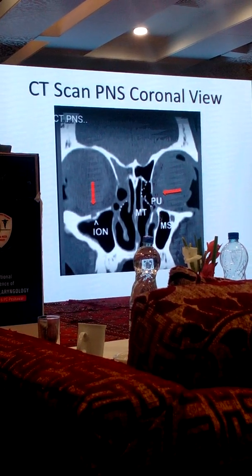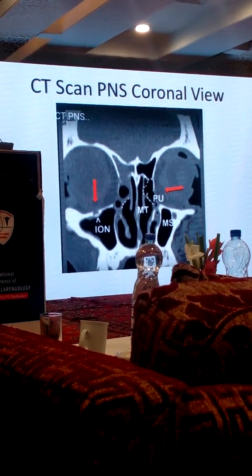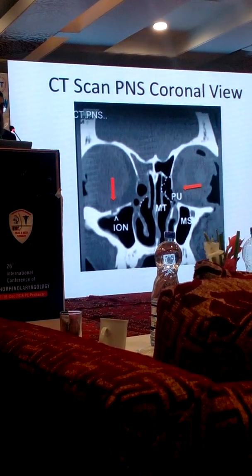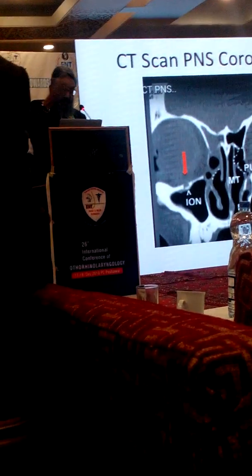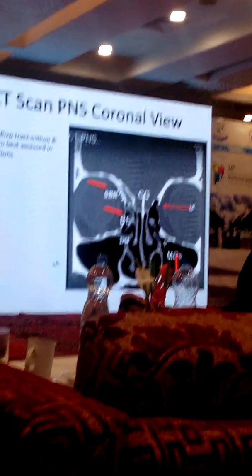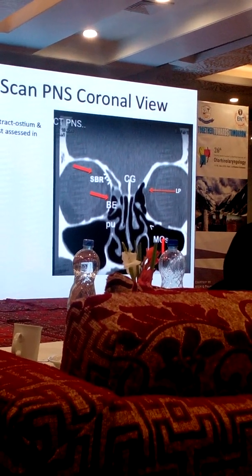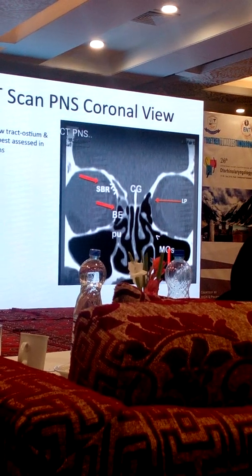Here we can see this is in continuation with the inferior turbinate. So we have to now follow this in every cut. This is the uncinate process. Once we identify the uncinate process in anterior cuts, now we are going to follow it posteriorly, where it is going to attach, either to the, I will discuss it later on, very little time. Okay. Now, ethmoid bulla. Why now it is not agger nasi, ethmoid bulla? I am skipping this right now. Middle turbinate, ethmoid bulla, uncinate process.